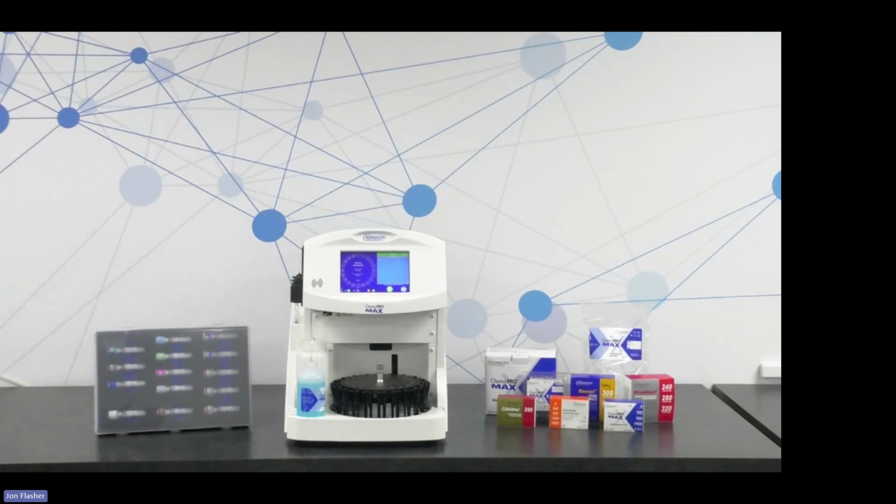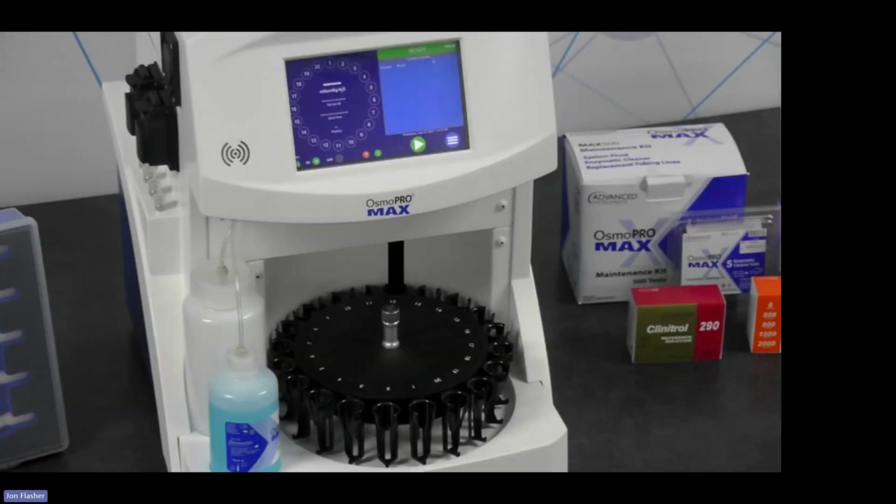And what I mean by fully automated is that it will run primary sample tubes. So you see this nifty turntable here. It has 20 samples. We'll give you a nice look at it from above here. It has 20 positions to accommodate 20 samples on the turntable. That will allow for continuous testing. So you can continue to load your primary sample tubes on.